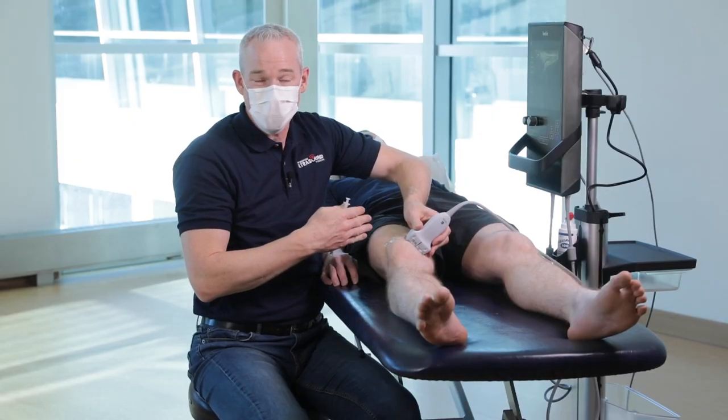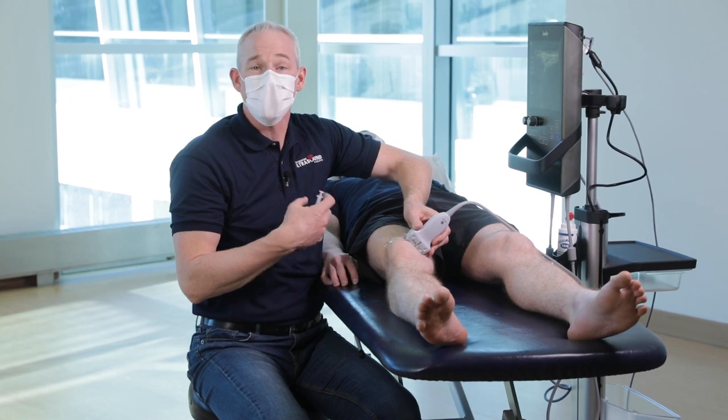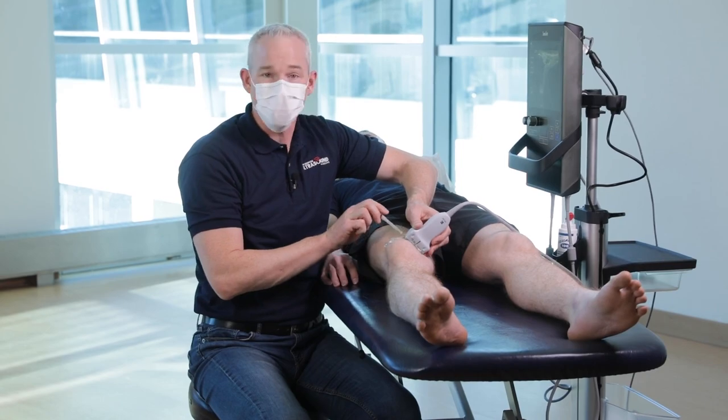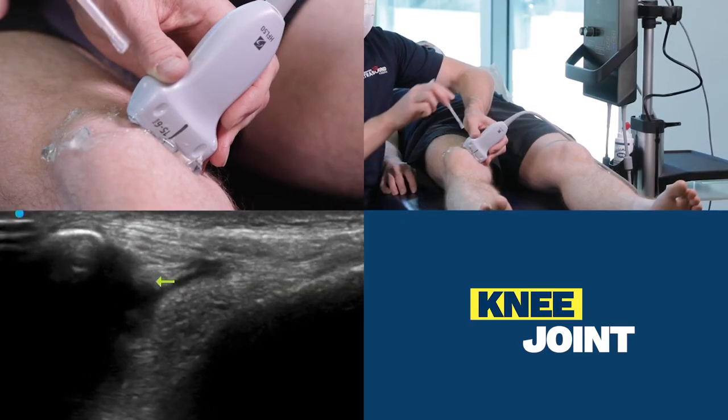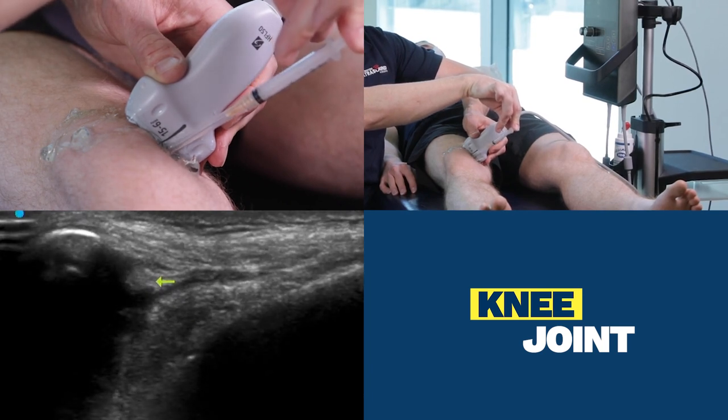So that's how I normally scan and inject the knee joint in the suprapatellar recess, but in the event you can't see enough fluid to inject, you can always default to this medial patellofemoral approach out of plane, straight down like this.